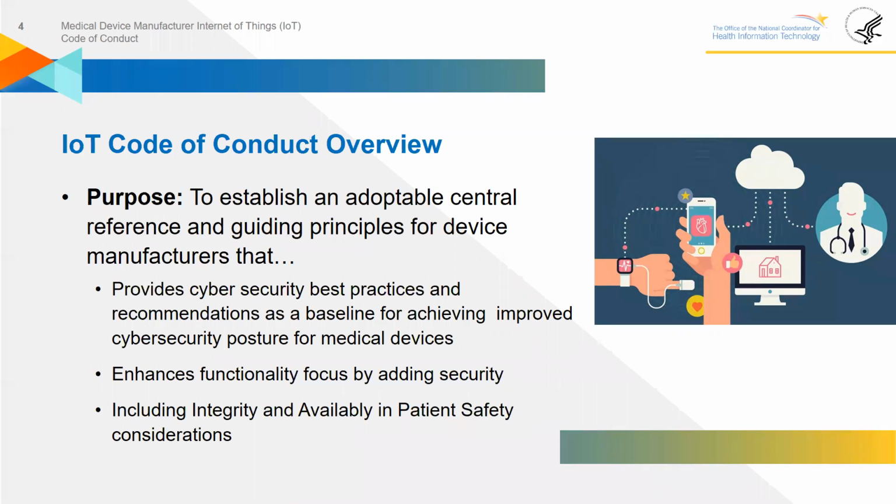The Internet of Things Code of Conduct draft document strives to provide the device manufacturer a comprehensive set of cybersecurity principles and recommendations that they can adopt in their current business practices.